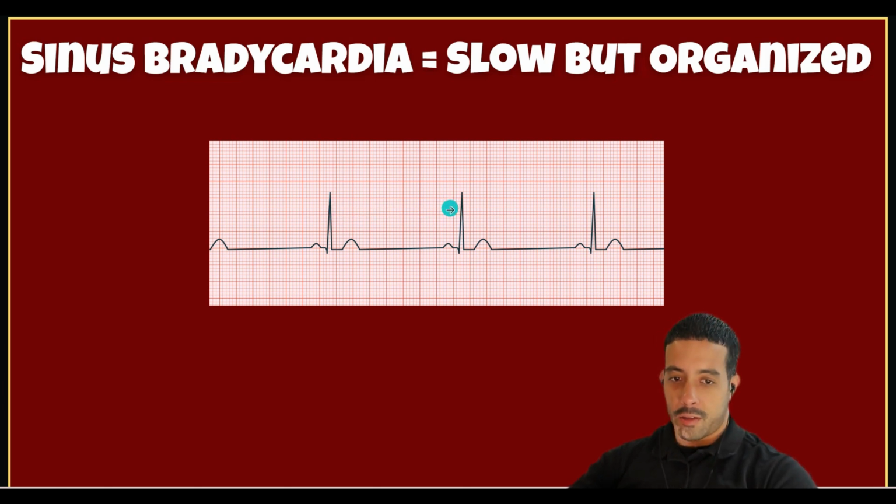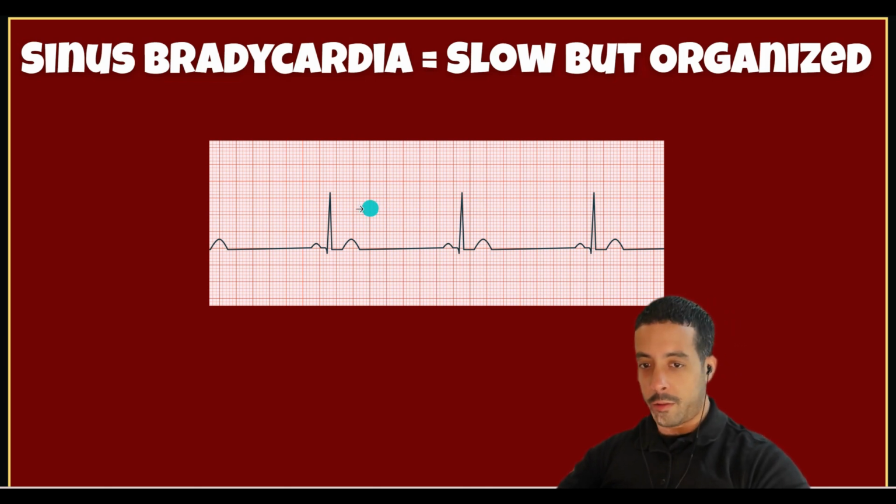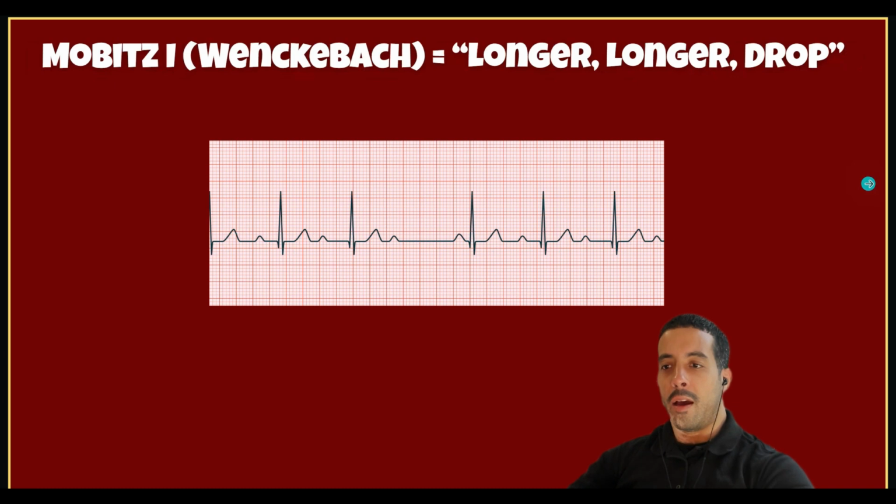And let's not forget to consider what's in between the beginning of this box and the R wave. So there's 2.5 plus 1 here. It's basically almost 7 boxes in between the R and the R. So the heart rate is obviously below 50. And that's how, at a glance, you're able to recognize how fast or slow a rhythm is going, based on what I just shared with you. So I hope that helps you understand that.